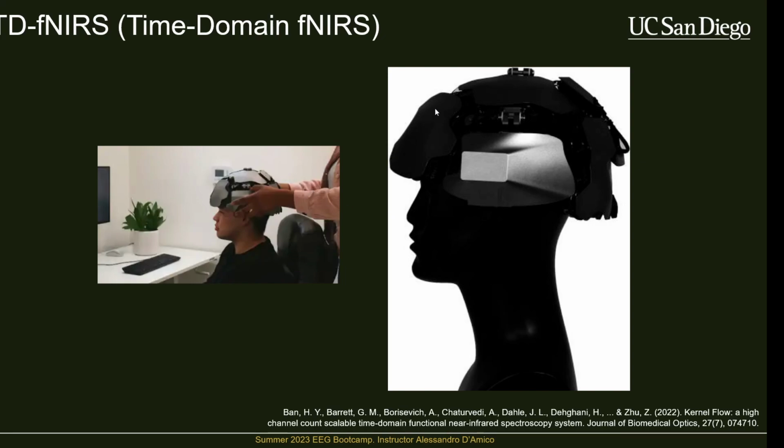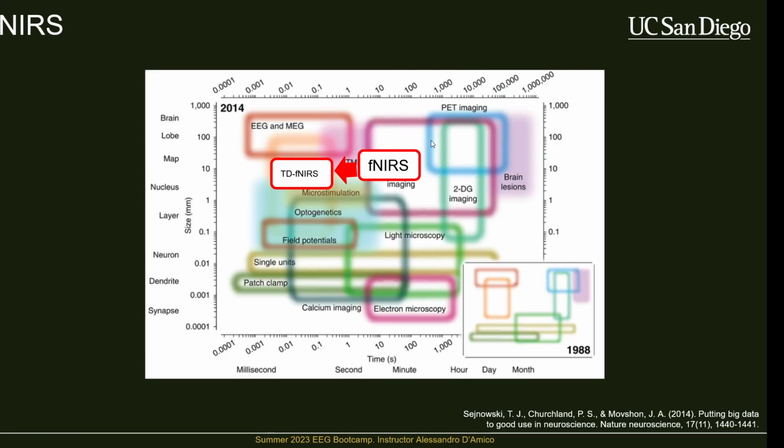I think maybe they sell one that's pure fNIRS. But they claim that they can get much faster temporal resolution, about on the scale of EEG. So in this case, fNIRS and EEG could be really useful. EEG is still going to be much faster and much cheaper to produce on average. But if you wanted more spatial information about exactly what's happening at more precise spatial regions, then combining the two might be useful.